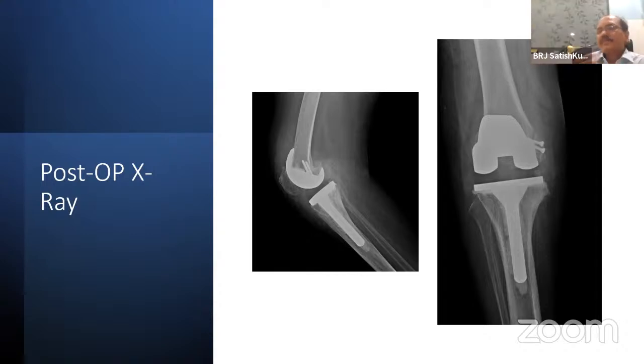It depends which gap you want or do not want. If you think the flexion gap is correct, you flex this. But basically we are doing it for extension, so we have to do it in extension. The only thing is, in extension, the fragment should not slide posteriorly. If it slides posteriorly, the flexion gap will be there. So we'll have to make sure that it is slightly anterior and then fix it in extension, because the idea is to get the extension gap, I mean, to correct the varus, no? Yeah, fantastic. Excellent. Proceed, Adarsh.